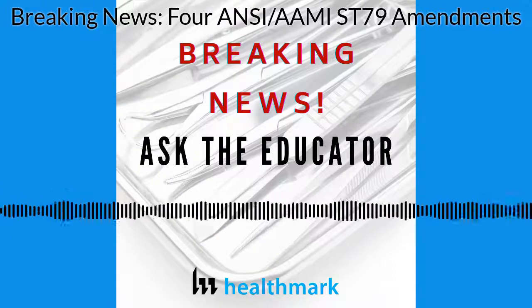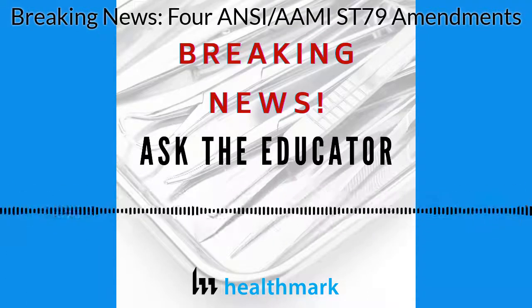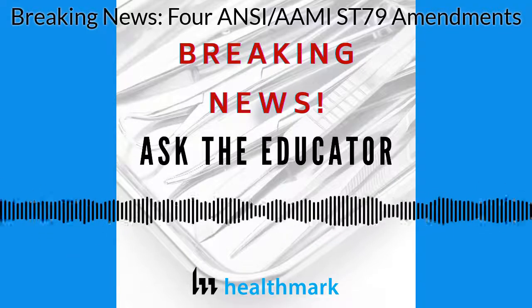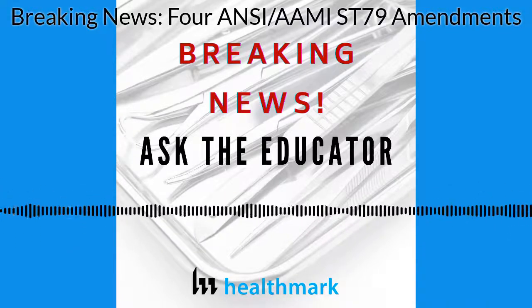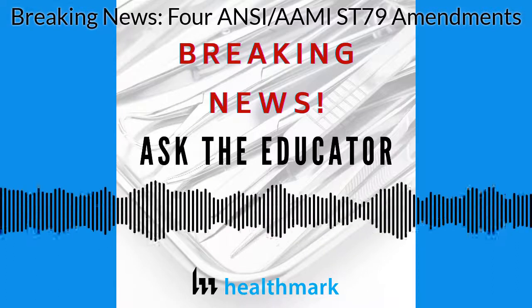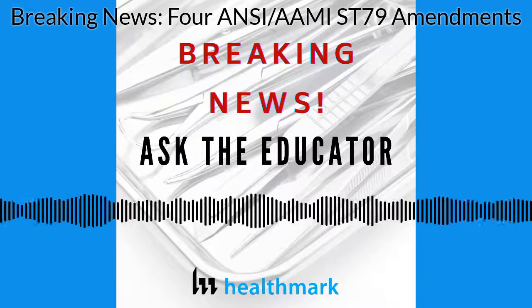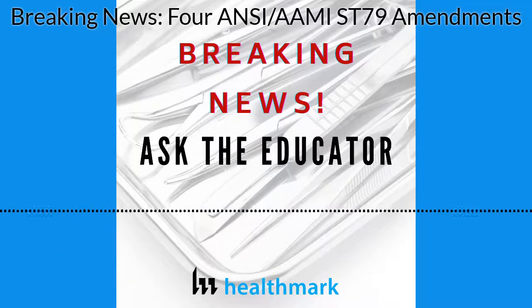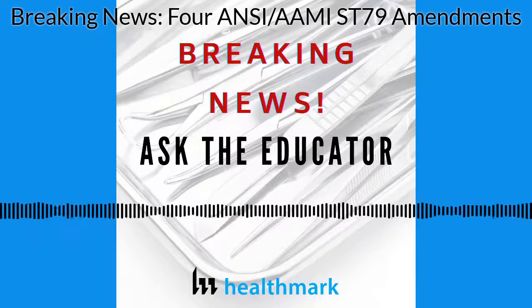And now regarding section 8.2.1, this one deals with the inspection of instruments that are intended to be used with electric current. In other words, your insulated instruments. And as we know, there are many different instruments that come with insulation, but one of the most common types are laparoscopic instruments. Now, this amendment gives us more direction on how these types of instruments should be inspected.